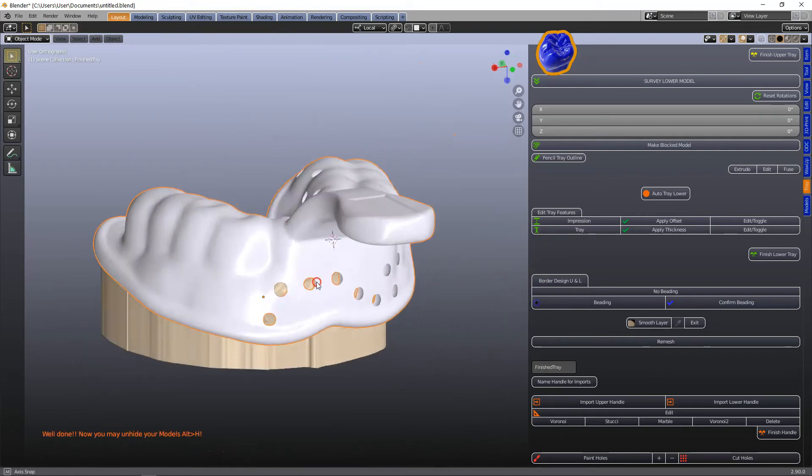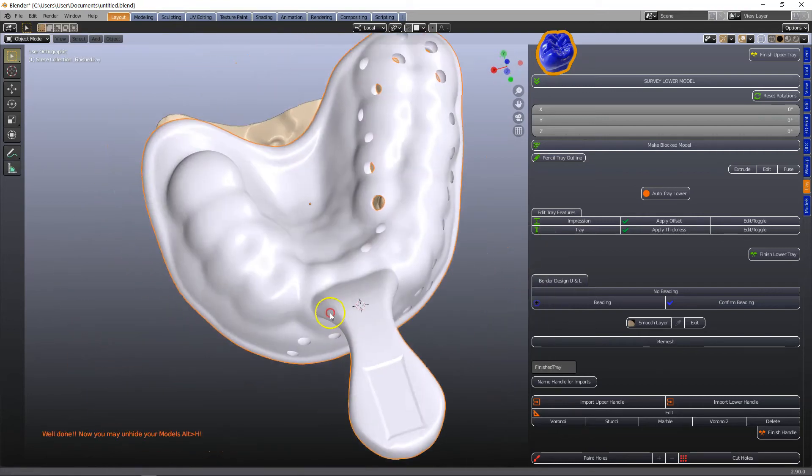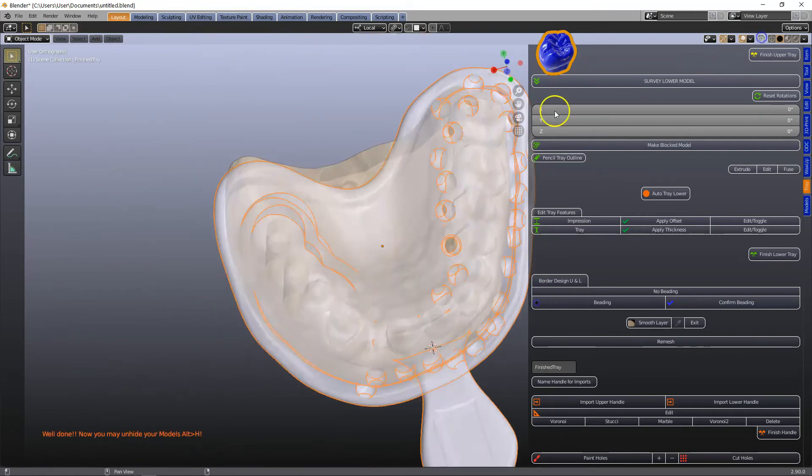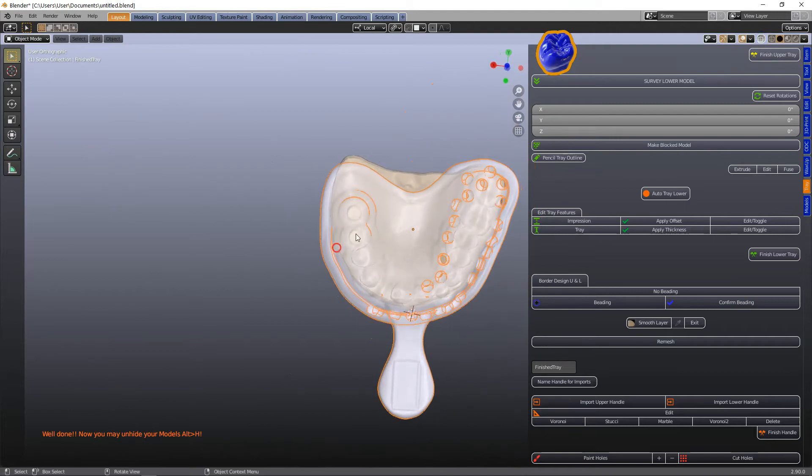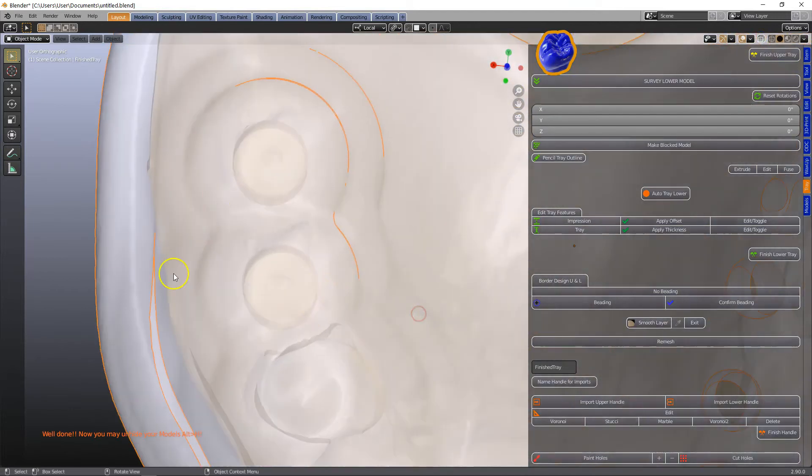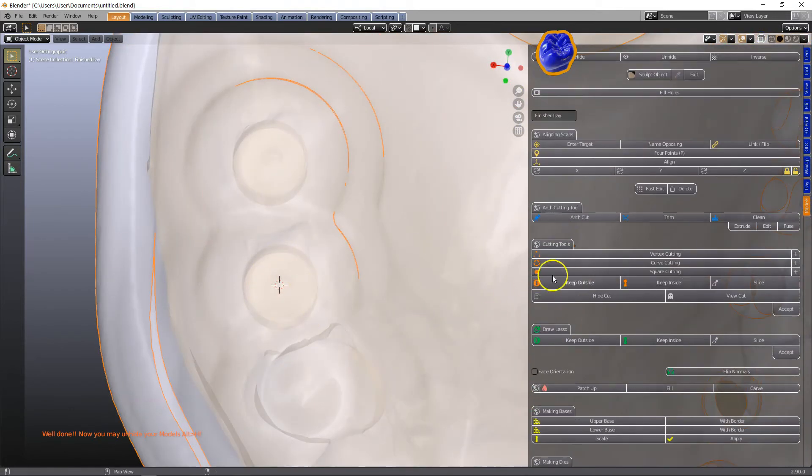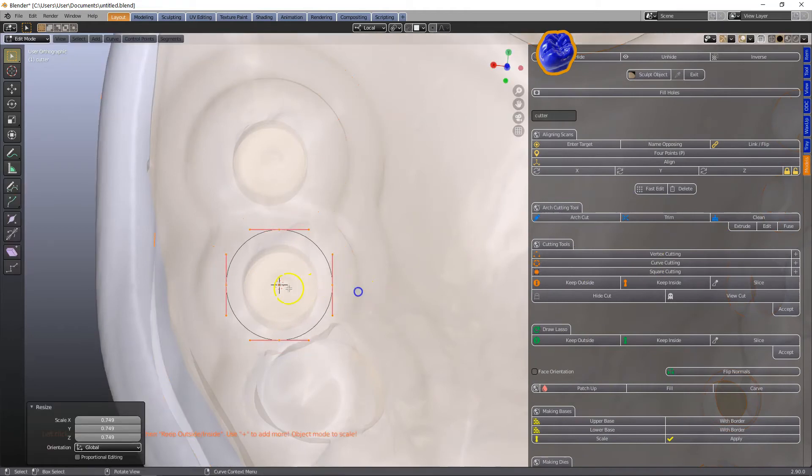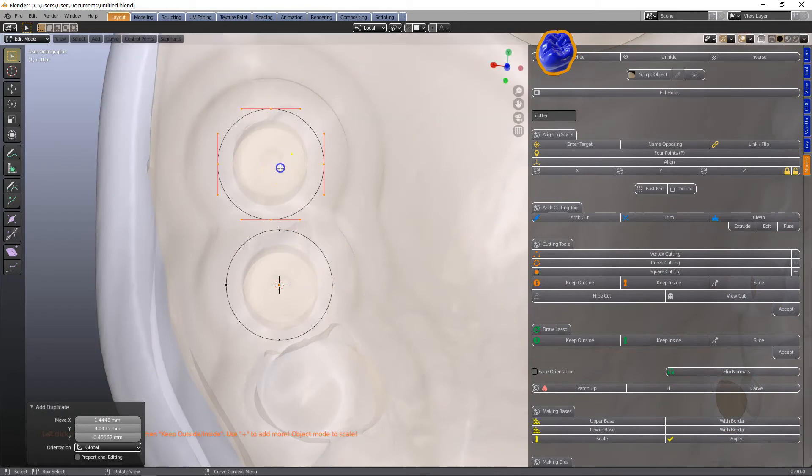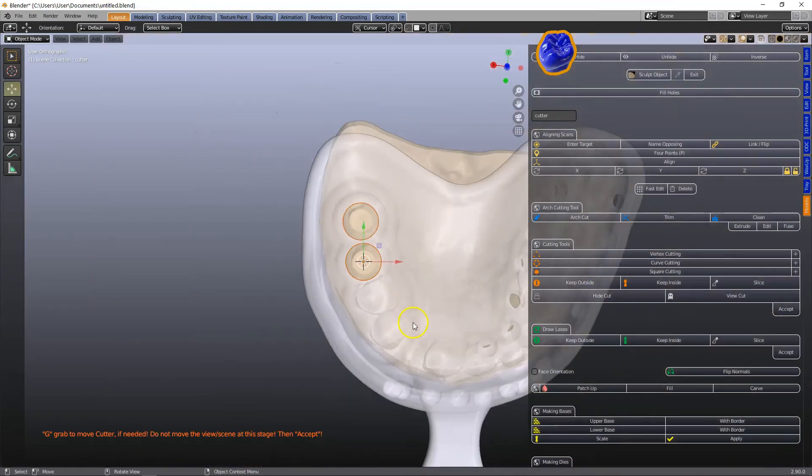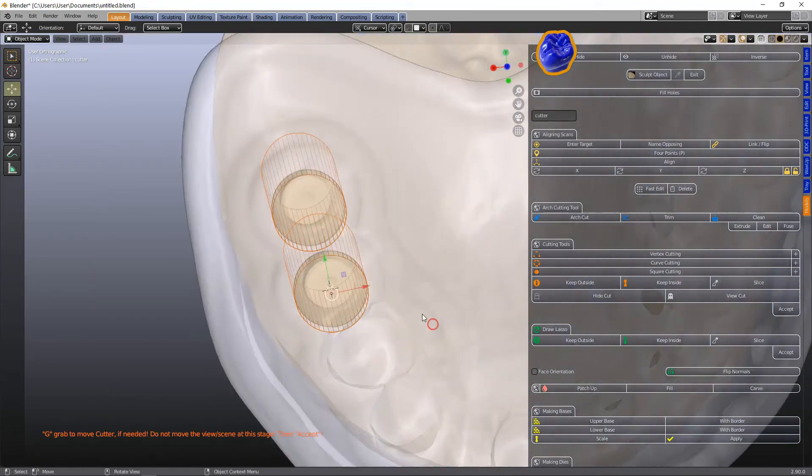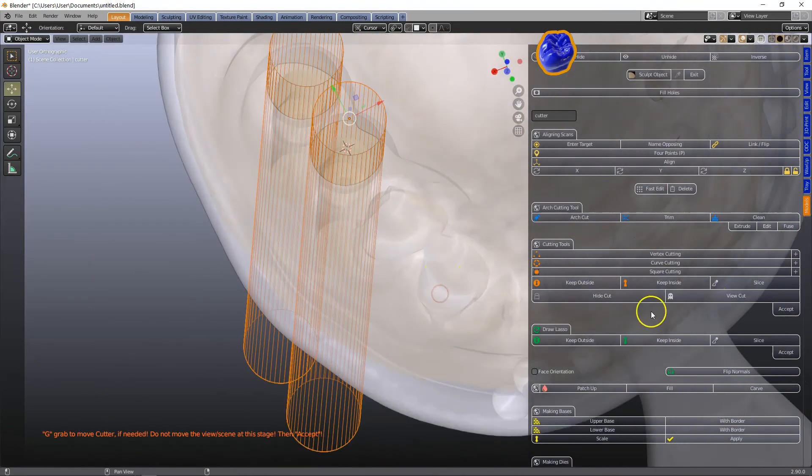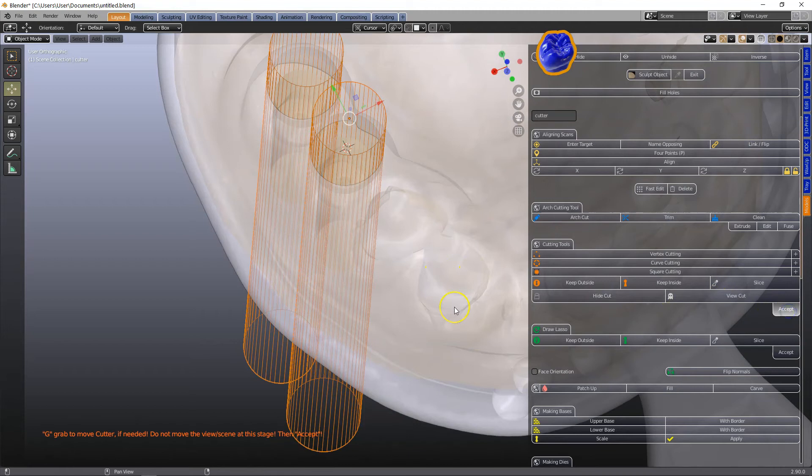Once that's done we still have to make our holes for our implant assemblies. So please go to the model designer. Click on curve cutting. Scale the curve. Shift D to duplicate it and click on keep outside. Then once you've confirmed where you want the cuts to be apply this.